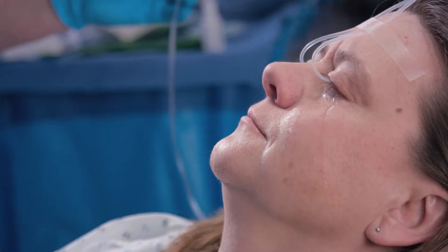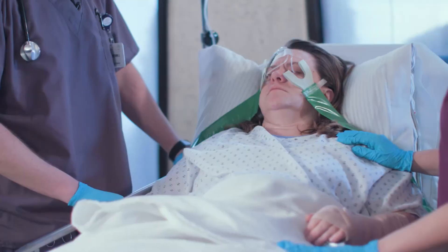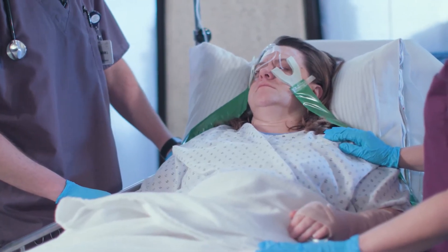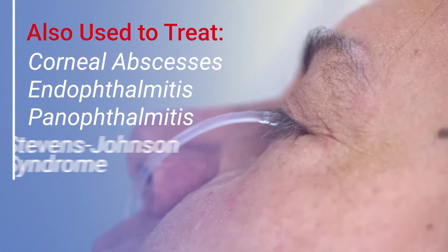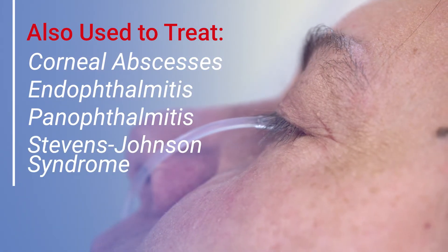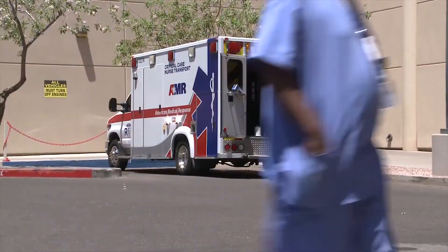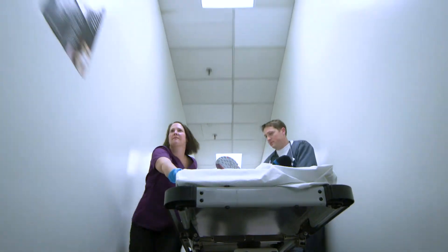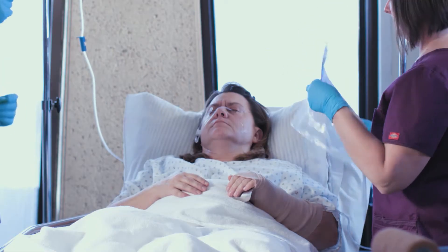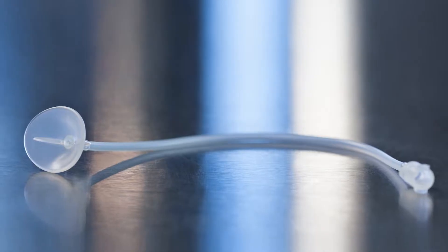The Morgan lens provides a fast, bilateral, hands-free method for emergency eye irrigation — one that gently irrigates or delivers a controlled dose of antibiotics to the cornea and conjunctiva. Immediate treatment of the eye calms the patient and makes it easier to work on other injuries. Just like over 90% of emergency departments in the United States, you should be using the Morgan lens.